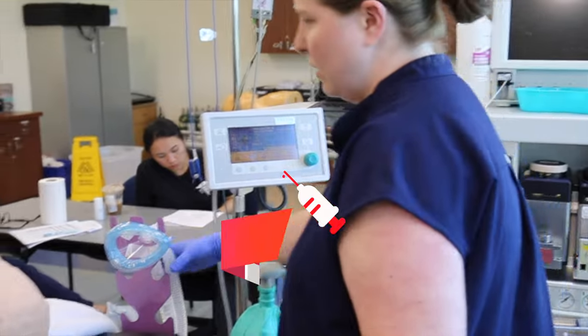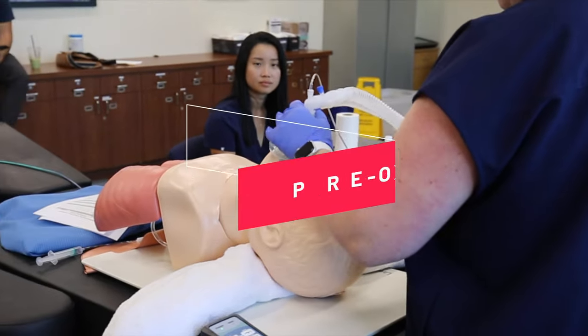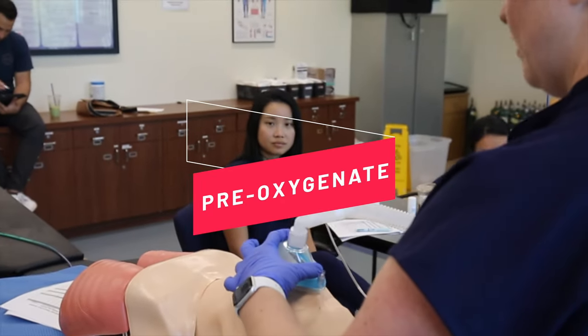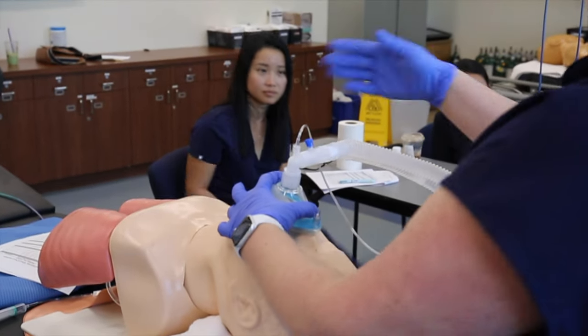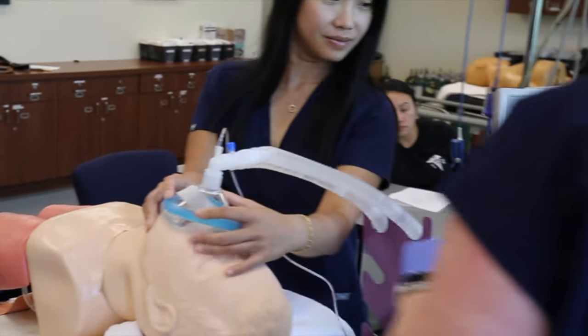Turning my O2 on. We're going to put this mask on you. This is the best air in the valley. Take some nice big deep breaths. Tilt your chin up for me. Excellent. Okay, nice big deep breaths. And then, Kenzie, will you hold this for me? So just hold the mask there.